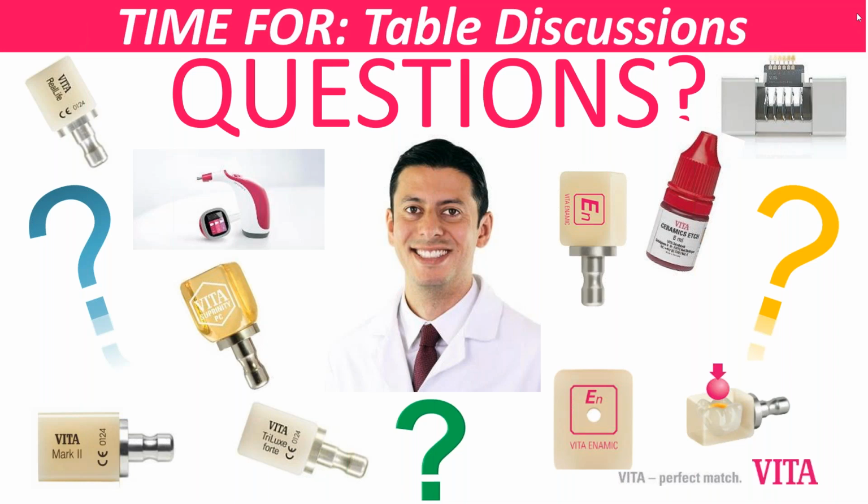All right, I think you kind of answered this during the presentation, but someone had a question: is the MDP primer the only material that can be used for zirconia? But I think you mentioned Panavia SA Universal is something that might be an alternative. Yeah, well, actually, the Panavia SA Universal has MDP, but inside the cement. MDP nowadays is the most successful monomer for bonding to zirconia. There are other options, okay, but in general, I would say that MDP is the one that has been more studied.